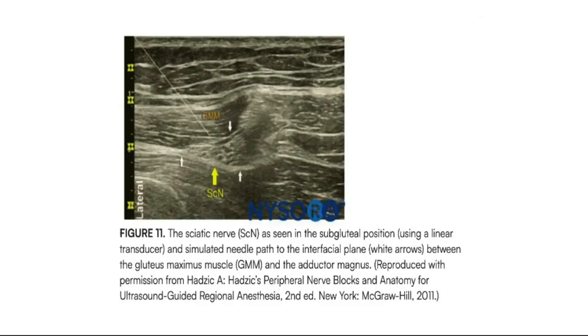So you must always scan proximally. And if you have doubt, put the probe slightly lateral, because the common peroneal nerve would split off and head towards the fibula neck. As you scroll up, you might see a nerve coming from the lateral side and then joining the nerve.